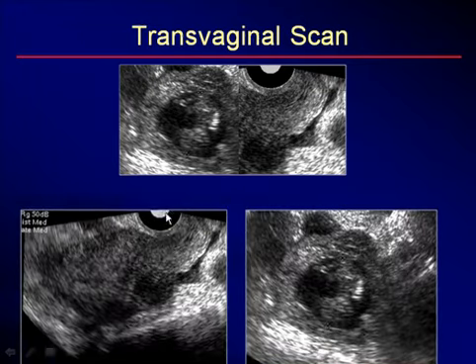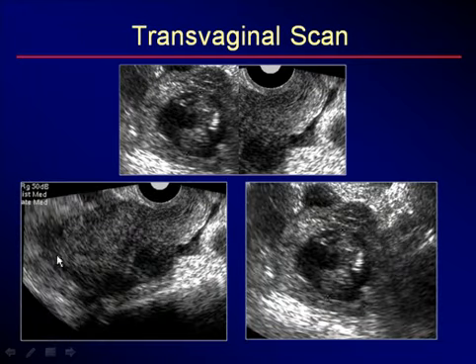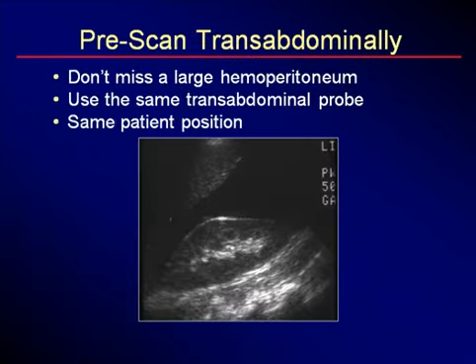What had happened here was the uterus was pushed way to the side, and the ectopic pregnancy was actually sitting in the middle of the pelvis, so that it almost looked like an intrauterine pregnancy. But because we knew that something was not right, we were able to find the uterus and make that call.